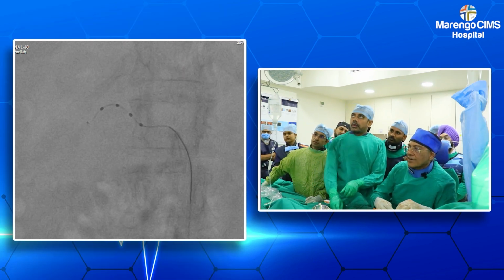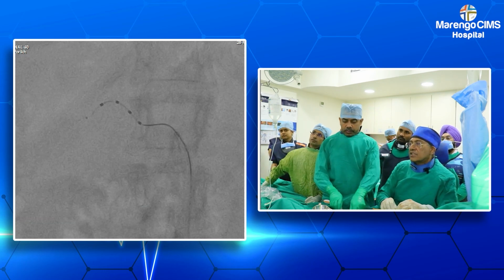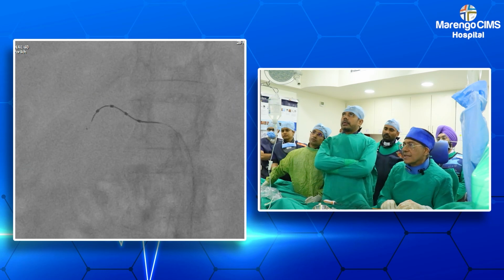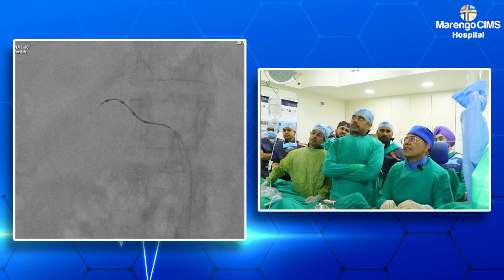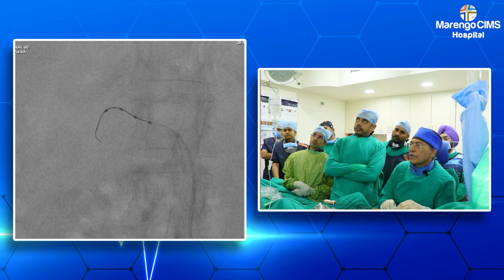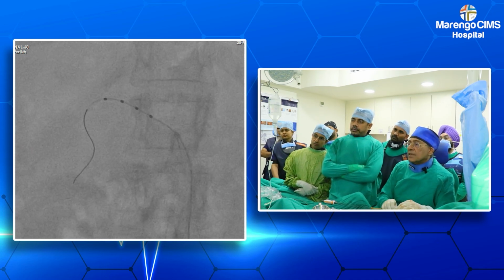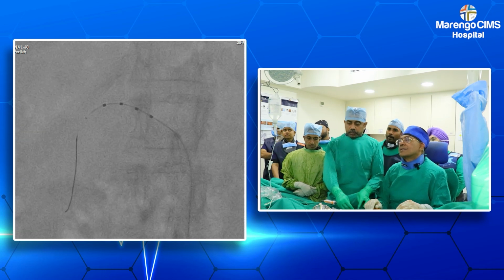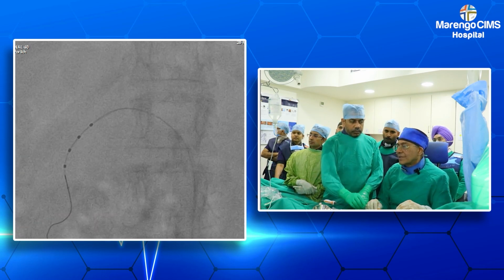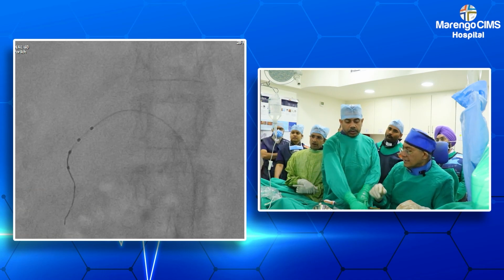So now we have guided our wire into the inferior branch, which appears to be about 3 to 3.5 millimeter visually in size. And it's a very long branch. So very likely we'll be able to introduce all 4 electrodes inside that branch. Again, let's go to the selective run. We confirm the size visually of the branch. Let's go and show me the run.